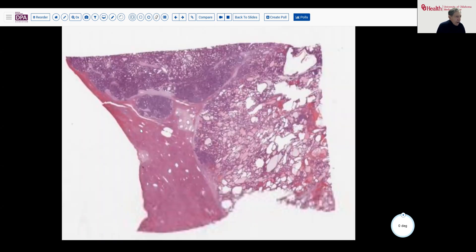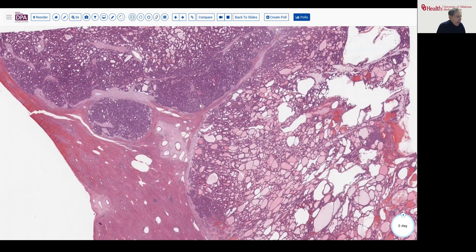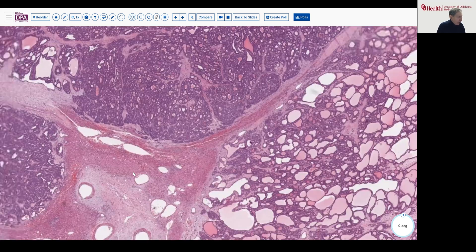Here's the resection specimen. At low magnification, it has some areas that look very thyroid-like — a very follicular pattern — with large dilated spaces with eosinophilic fluid, other areas with more amphiphilic or blue staining areas, and sort of a multi-nodular pattern of appearance.